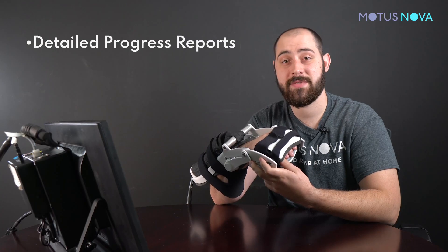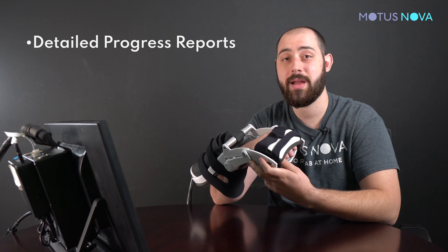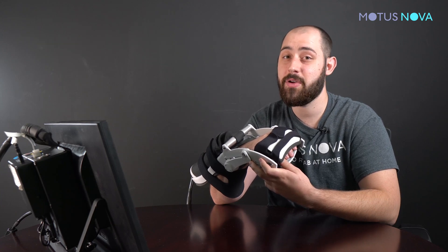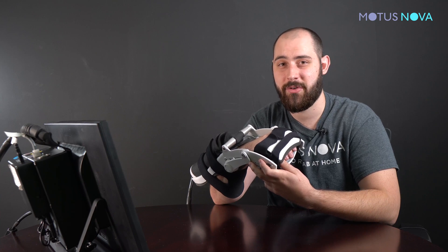Because the Modus screen saves all of the data from your therapy sessions, we're able to generate progress reports. You and your physical therapist are able to view these reports and better plan for your long-term recovery. The angle sensor detects even the smallest improvement that you may not notice. Because we measure in such fine detail, we push you further so you can progress faster in your recovery.